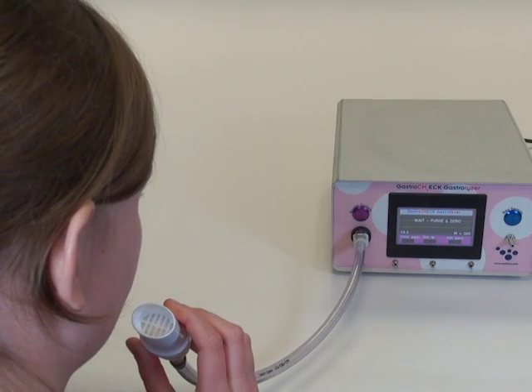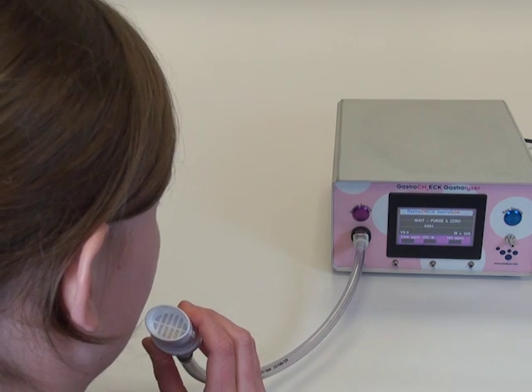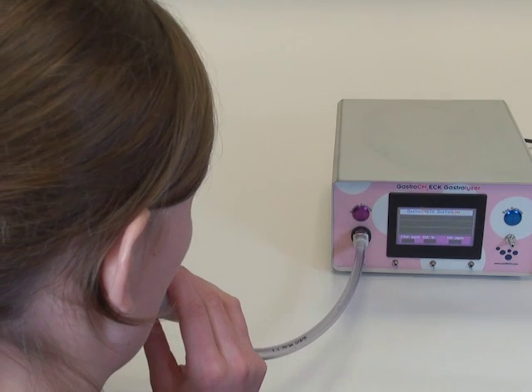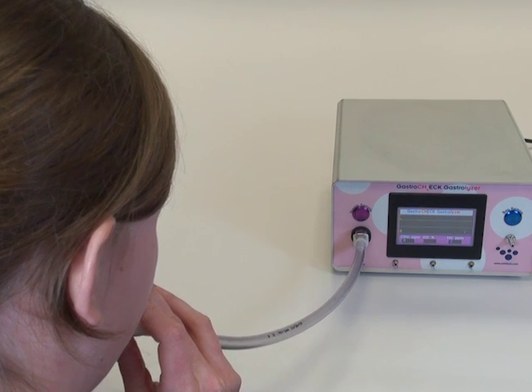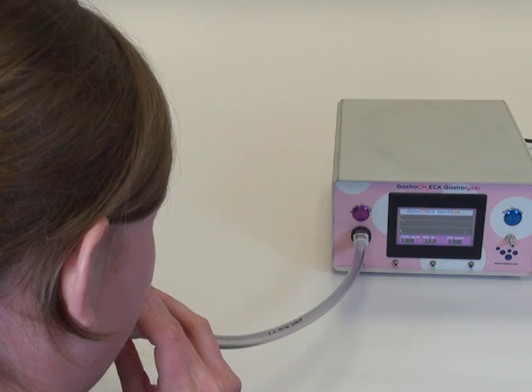The test will commence after a beep. You'll notice the O2 value decreasing during the test — it starts from 20.9%, and the patient should aim to get this as low as possible. If the patient does not get below 13.9%, the Gastrocheck Gastrolyzer will recalculate the readings. Once the patient has ceased exhaling, they should press the breath test button to stop the test and bring up the results screen.